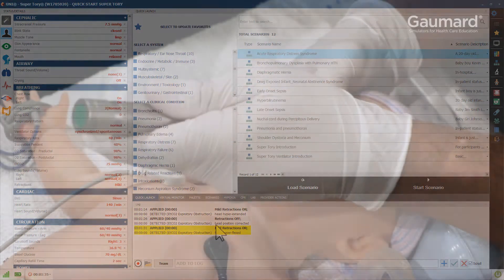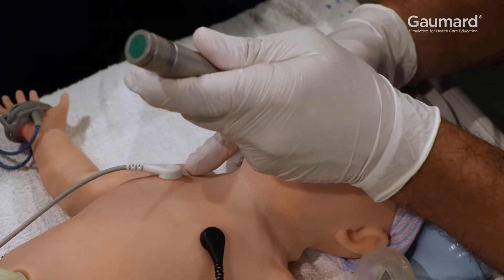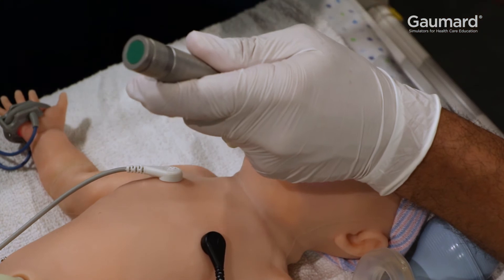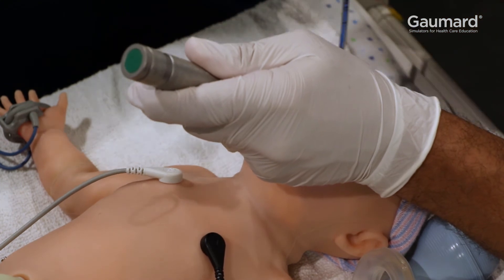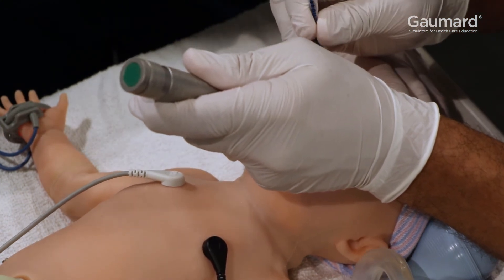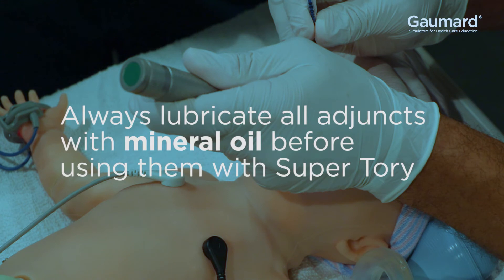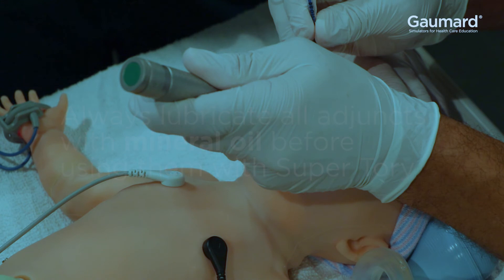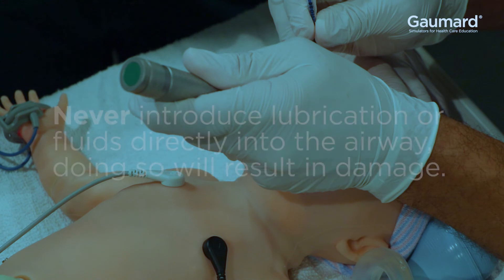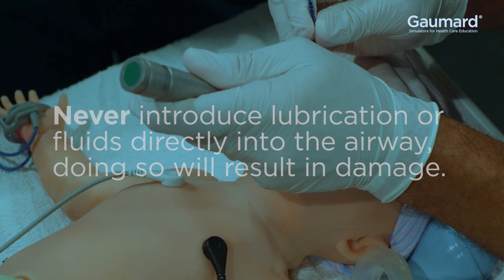Supratory's airway supports standard adjuncts. Size 3 and 3.5 endotracheal tubes work best with Supratory. Always remember to lubricate any instrument before using it on Supratory. Never introduce fluids or lubrication directly to the airway, as doing so can damage Supratory.